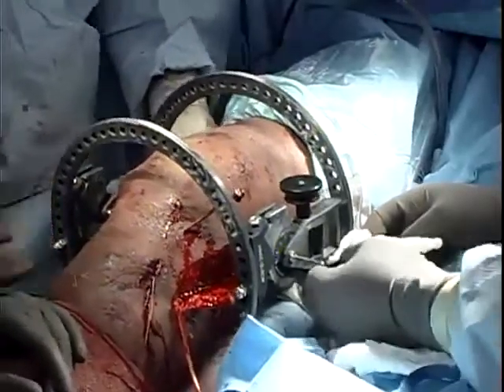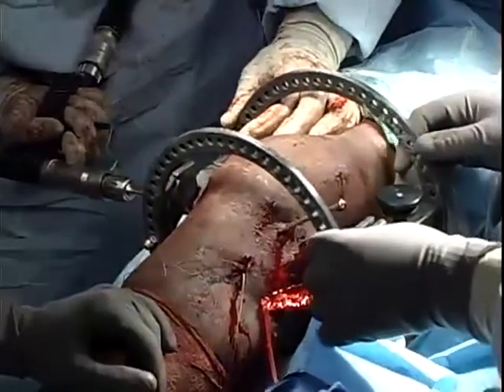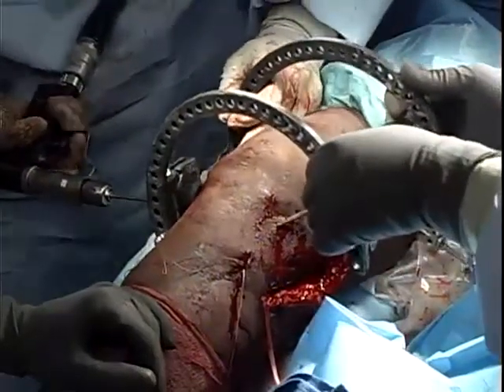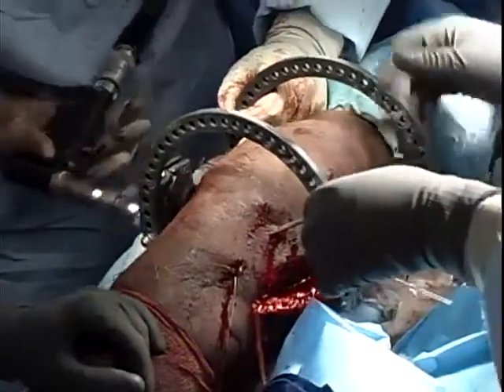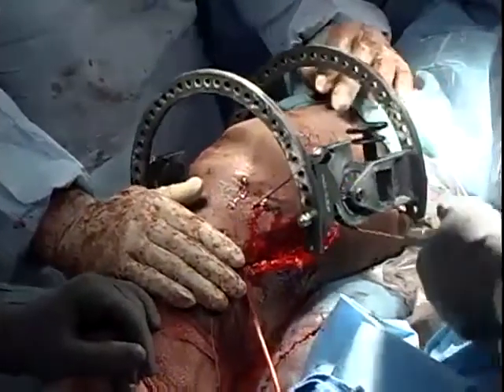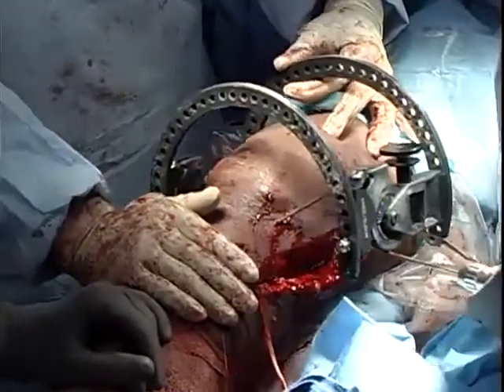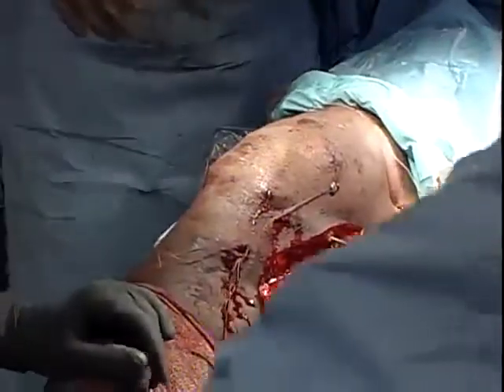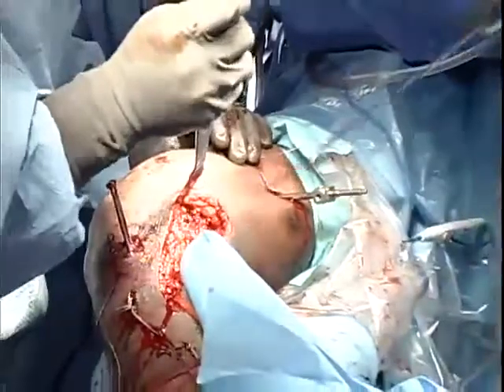If additional reconstructions are needed, remove the reference wire and take the hinge to the back table. Complete the reconstruction — in this case a posteromedial corner reconstruction. When finished, the compass hinge will be brought back. Here we are removing the reference wire to proceed with the rest of the case.